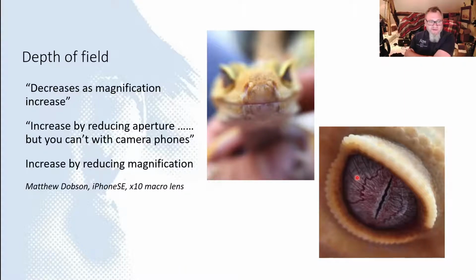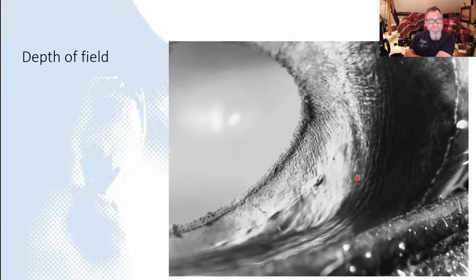So that depth of field becomes very, very narrow as we increase magnification, and we see that with slit lamp biomicroscopes, which is one of the tools ophthalmologists use routinely. One of the skills we have to learn with that instrument is to be able to move it backwards and forwards in millimeters and sub-millimeter distances in order to focus on the front or the back of the cornea, for example.